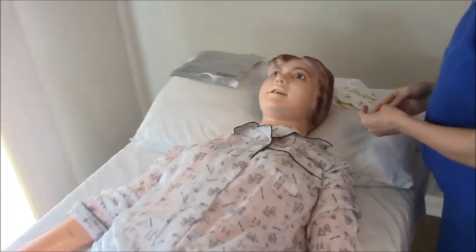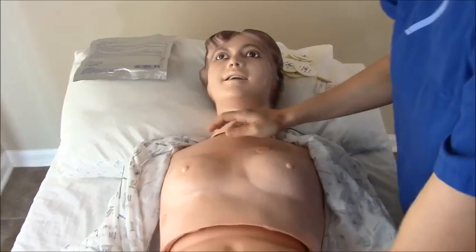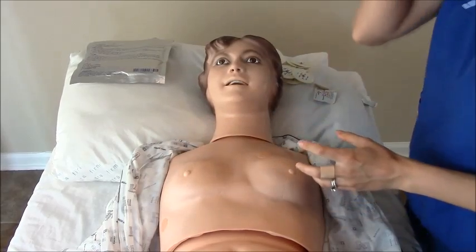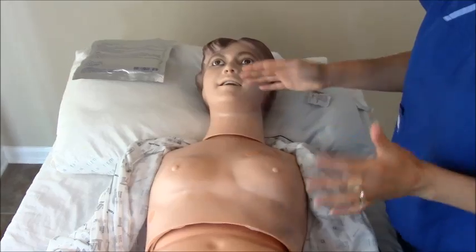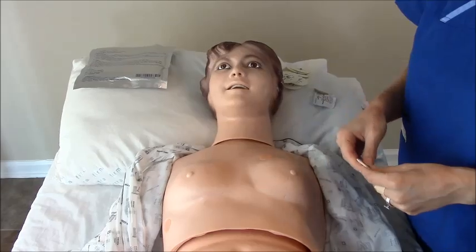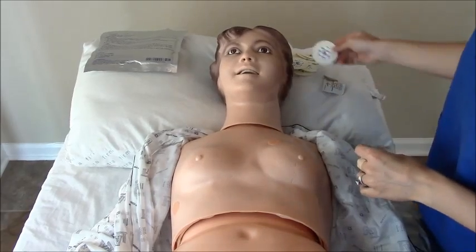First, you've got to expose the chest, so always warn your patient about that. With male patients who are very hairy, you'll need to trim the hairs. A lot of men have a lot of hair in this region, so always trim those. I've had patients where the sticker was placed over the hair, and when I removed it, it pulled their hair and was very uncomfortable. We could have saved that by simply trimming the hair first, so if you have a hairy chest, please trim that before you begin.